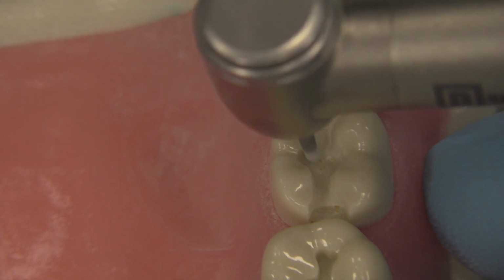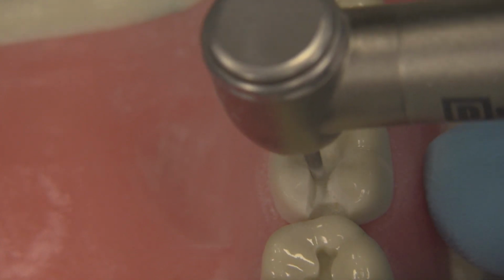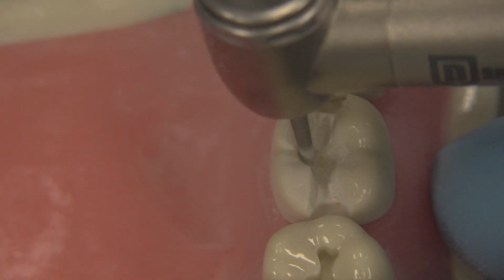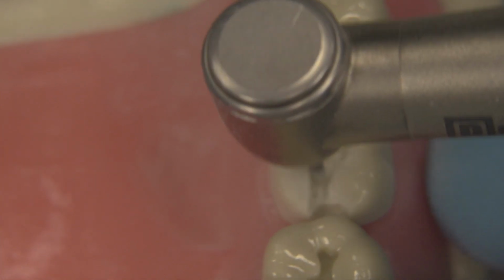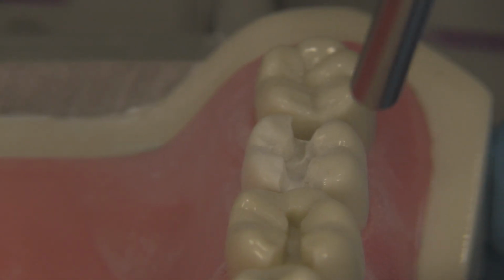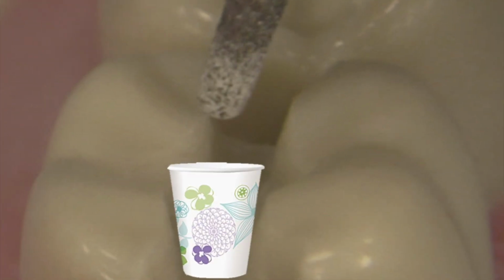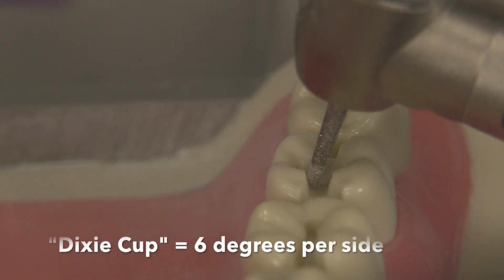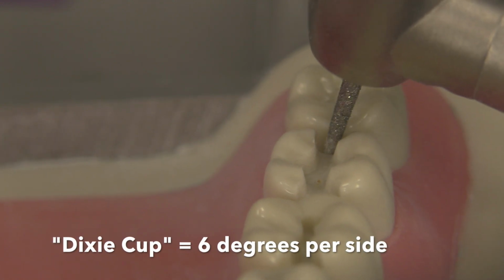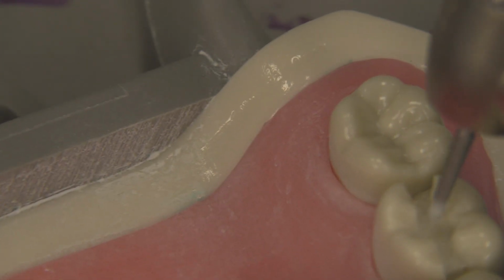If you're dropping your pulpal wall down a little further, not a problem. Lean the burr towards the distal here and towards the mesial here. And you need to be able to see Dixie cups. Okay, you see the Dixie cup right here? And you need to find another Dixie cup back here. Do you see it? Then you know you've got draw. And if you don't see Dixie cups, you need to keep going until you have it.